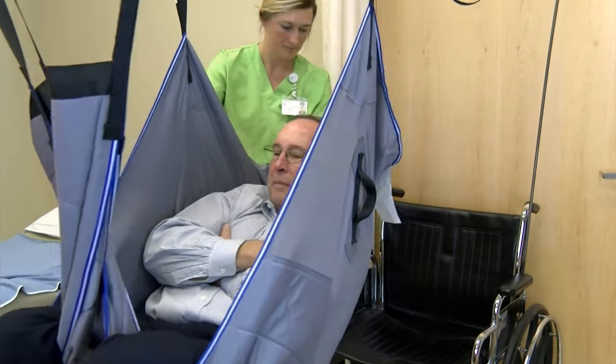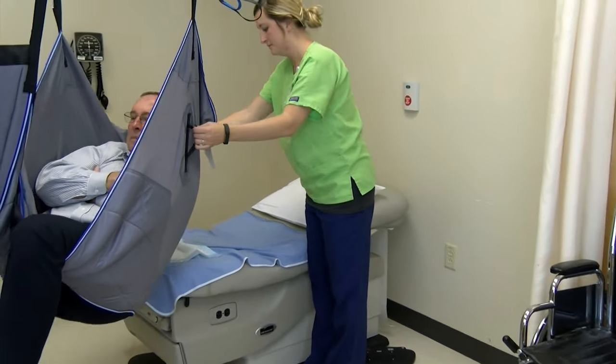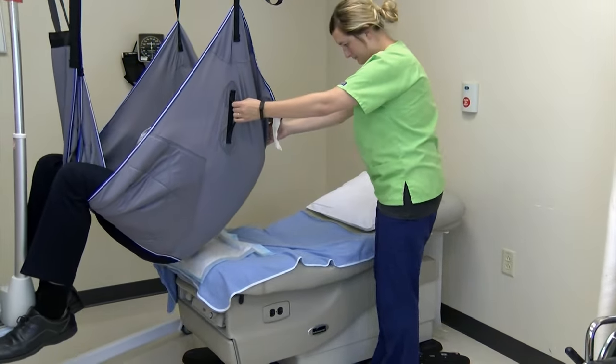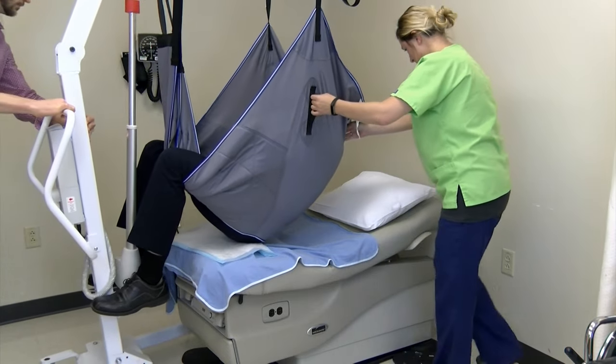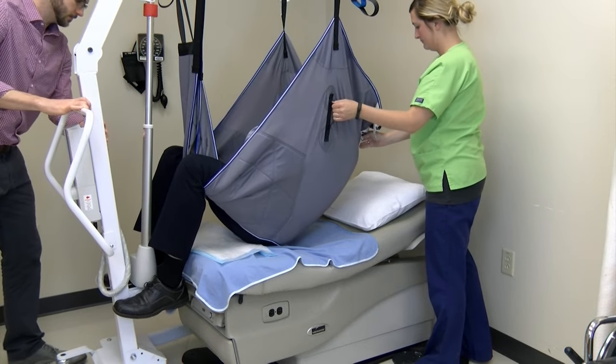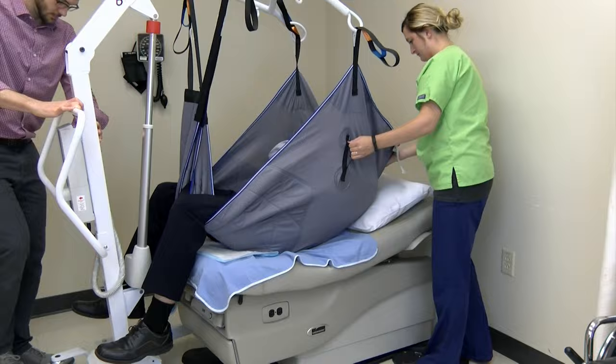Gently turn the lift toward the table and position the patient over the middle of the table. Rotate and properly position the patient over the bed. Lower the patient onto the table. Once the patient's full weight is on the table, you may lock the casters again and remove the straps from the lift.